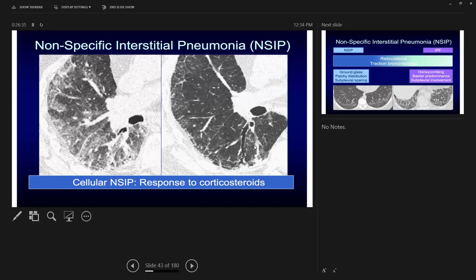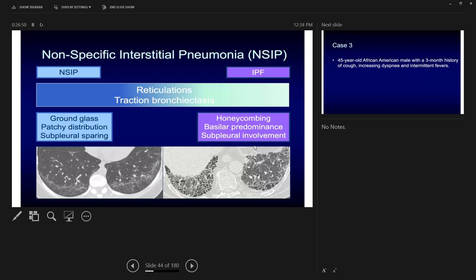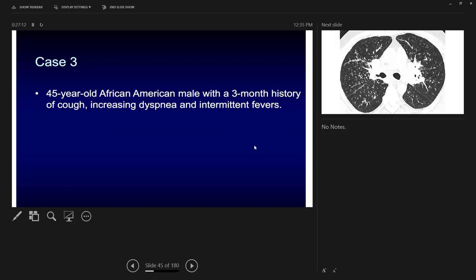Cellular NSIP has more inflammation and shows good response to steroids — you can see improvement from left to right on sequential CT scans. These diseases are mostly related to underlying connective tissue disease and can respond well to treatment. The key differences between IPF and NSIP: IPF has honey combing, basal predominance, and sub-pleural involvement; NSIP has more ground glass, patchy distribution, and sub-pleural sparing.